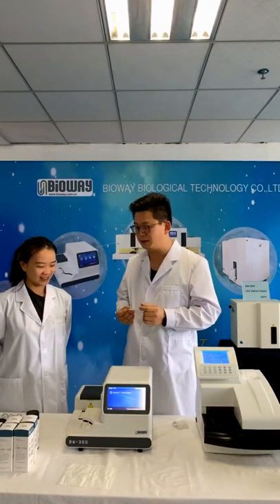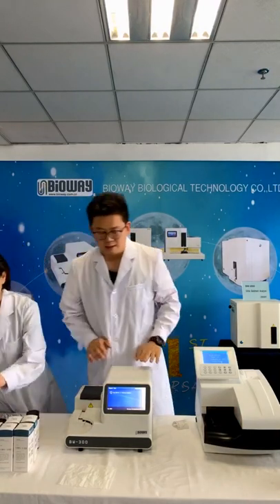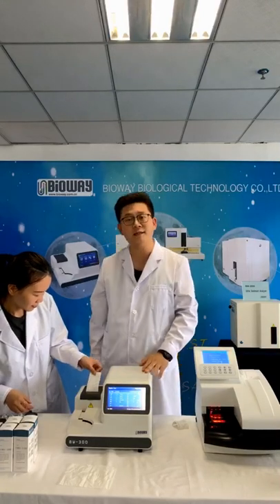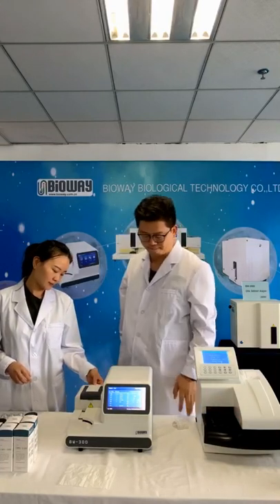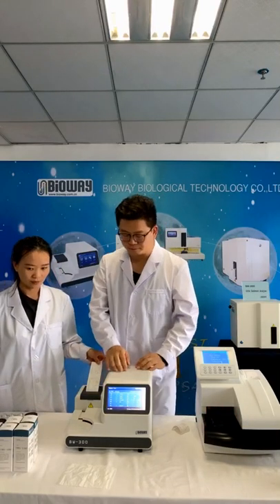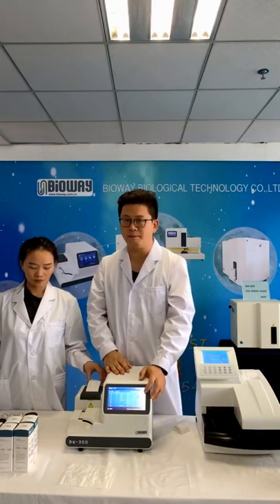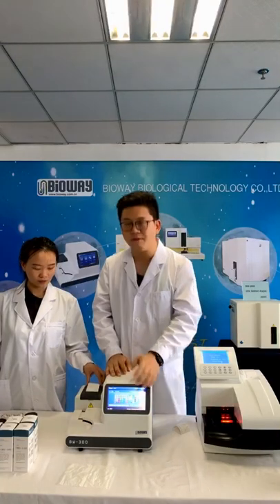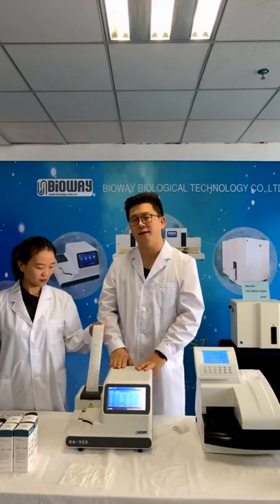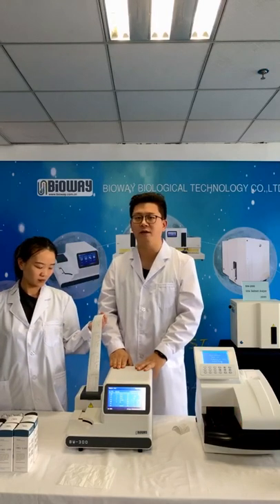Yes, we just use 5 strips as a sample. At this moment, we have to wait approximately half a minute for the chemical reaction. Yes, we got the first test result. The first test is completed. We can see the screen; the result has been updated one by one. Also, the photo has been taken by the built-in camera, just like this. You can find the image. It's very convenient for the laboratory technicians to do cross-checking and review.